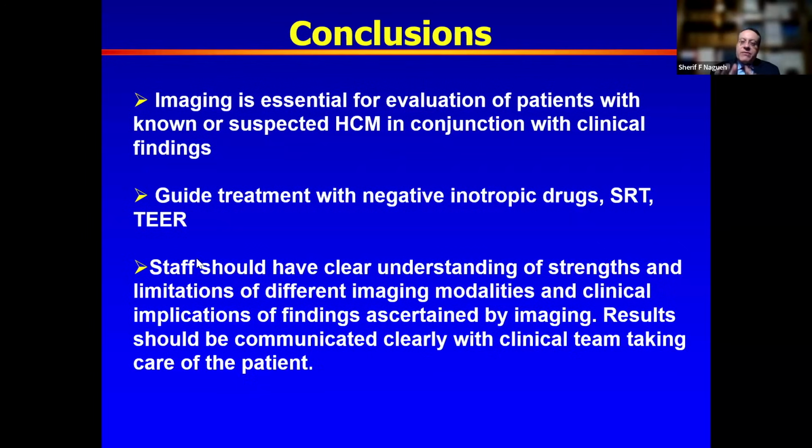Having said that, theoretical difference between exercising in an upright and in a supine position, one study, albeit a small study, showed no significant difference in gradients between the bike and the upright. In our lab, we do treadmill exercise. We do not do the bike for dynamic obstruction. The sonographers will have to be quick in this situation.